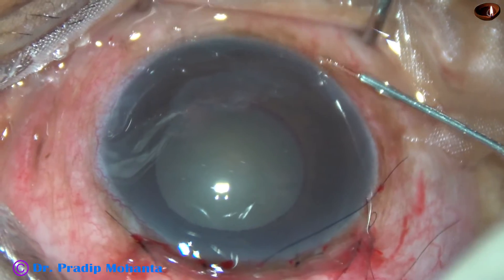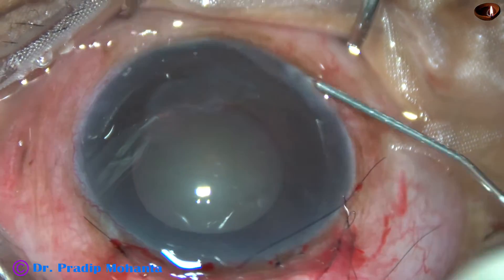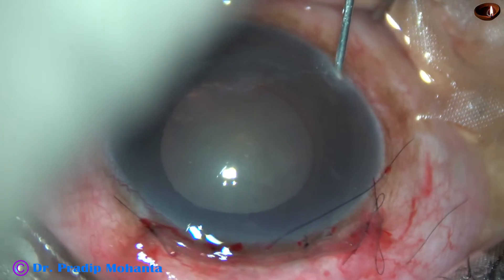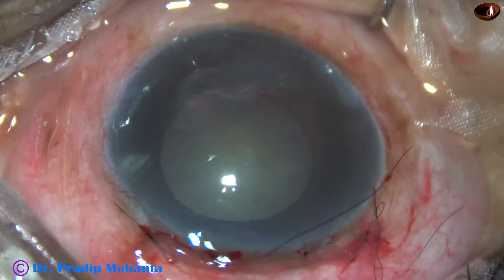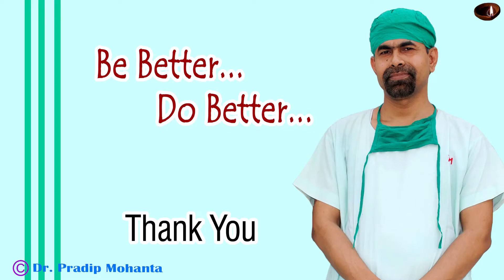Now this is moxifloxacin — I am hydrating the corneal stroma to close the side port, and a portion of the moxifloxacin is going into the anterior chamber. The anterior chamber is nicely formed. Thank you very much for your attention — hope this video will help you in learning trabeculectomy.